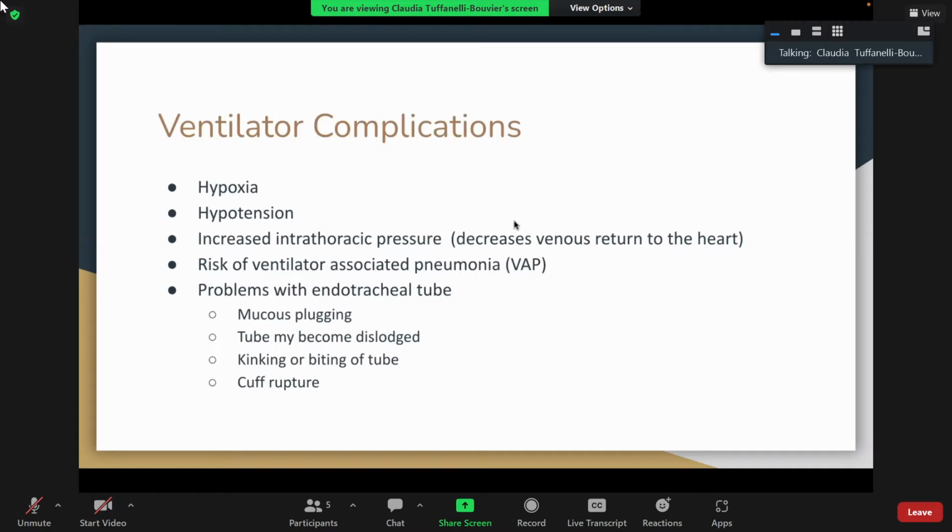So complications from intubation, they are many, but important. We're just going to talk about a few of the really key ones. So the biggest complication is hypoxia. That's during the intubation and while somebody is on the ventilator. You're hoping that they're not, but you have to look. So that is a great, easy one to notice. Somebody's hypoxic, so you can watch the pulse ox very easily. Are they hypoxic? Is their oxygen dropping? Get a good pulse ox if you have a patient that's intubated, something that's reliable, that's not coming off. You have to have a good waveform and look for that.